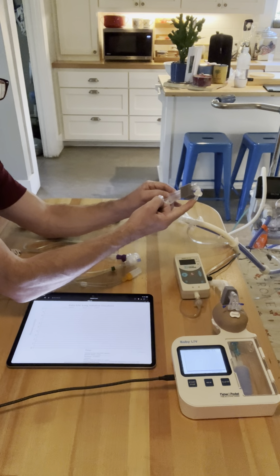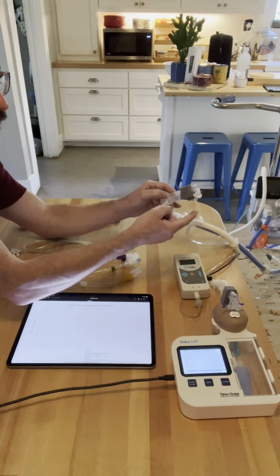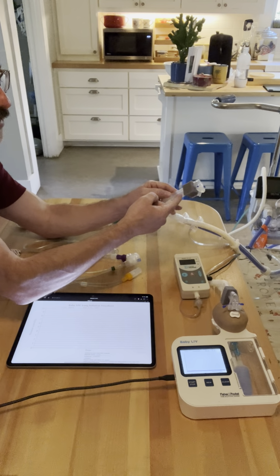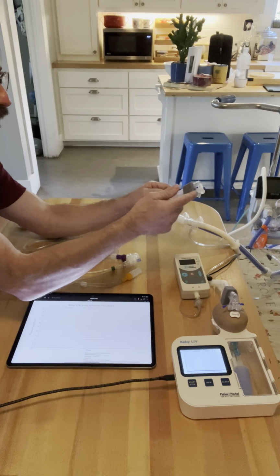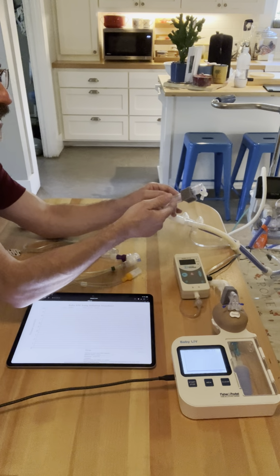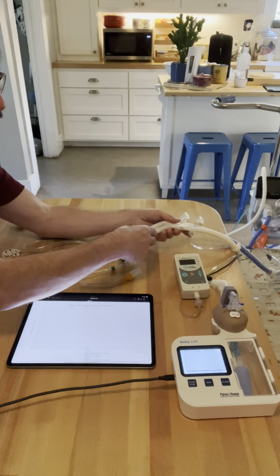And the nose of the baby is right here. So when they breathe against those prongs, they're able to exhale out of their nose against those prongs, regardless of the CPAP. Well, I mean, if you set the CPAP at 5 or 10 or whatever, they can exhale against that, keep their mouth shut, and maintain that constant positive airway pressure.